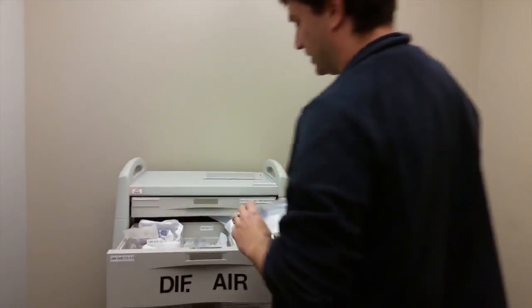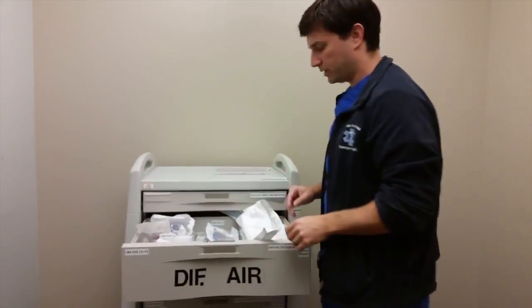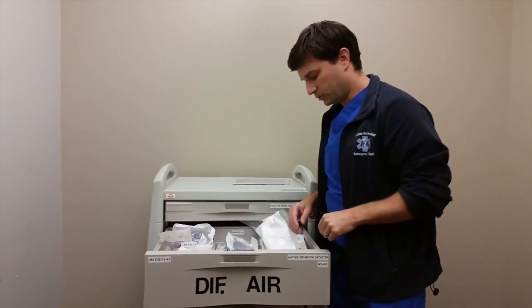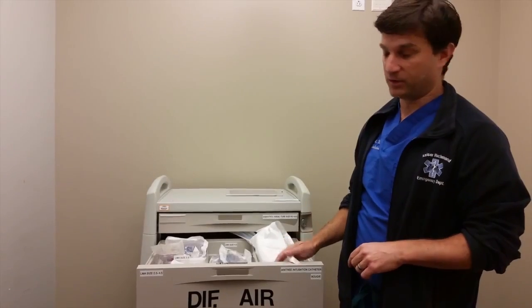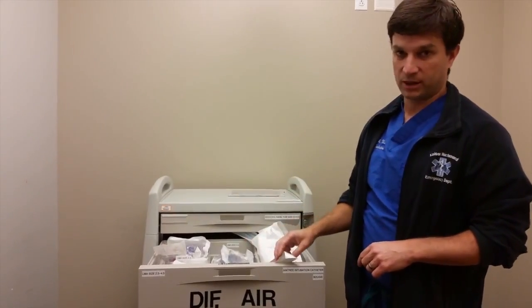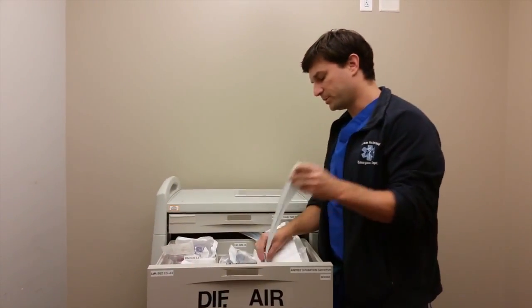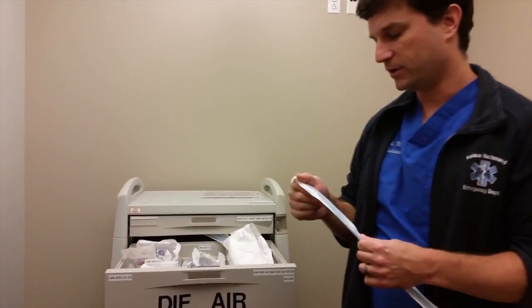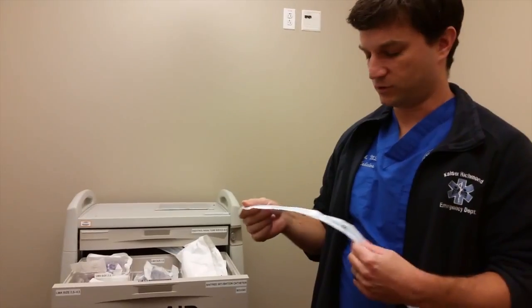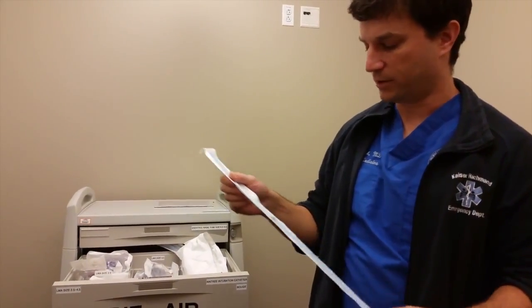So those are key, and that's why they're kind of the second drawer here, is that when you're really up against the wall and you've tried to intubate somebody, you can't bag mask valve ventilate them, you should grab the LMA as your first thing. Also up here will be the case where you can ventilate somebody with a bag mask valve, but the intubator's having trouble actually passing the tube or can't see it well.